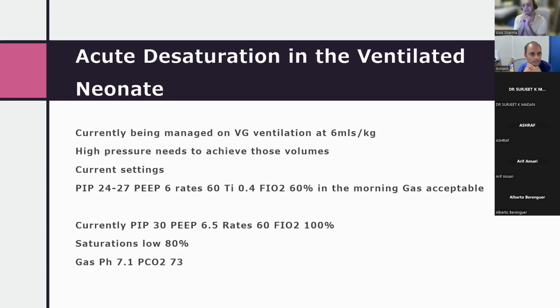Beautiful. This is beautiful. So, guys, for all of the 14 people who are here with me today, what Avinash is doing is classically what we call mental modeling. He's thinking of the history and thinking of his differential diagnosis. I want you to do this every time before you go into your lung ultrasound. You don't feel there's enough evidence for pneumothorax, but this is a baby who's previously had E. coli sepsis.